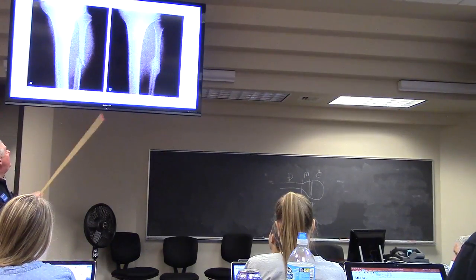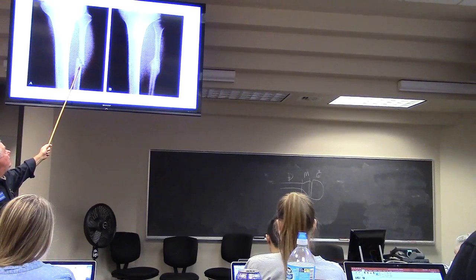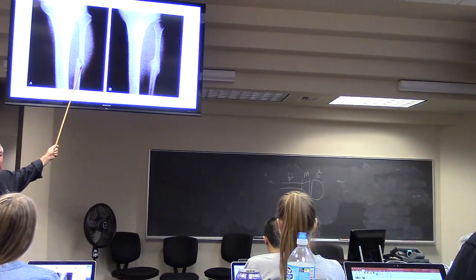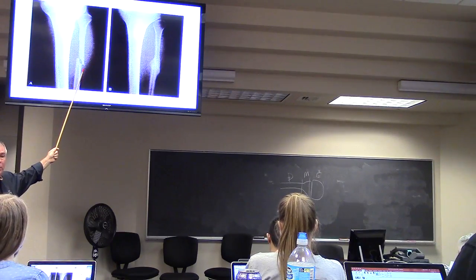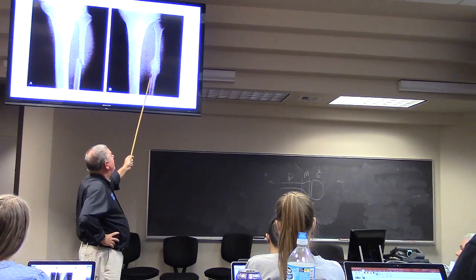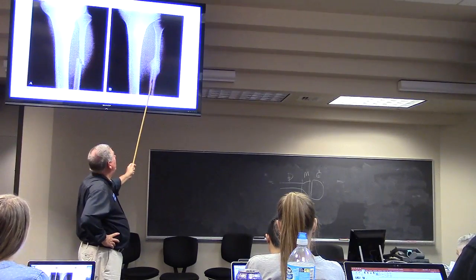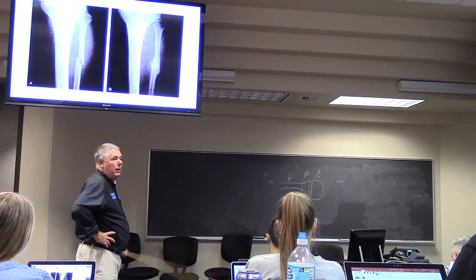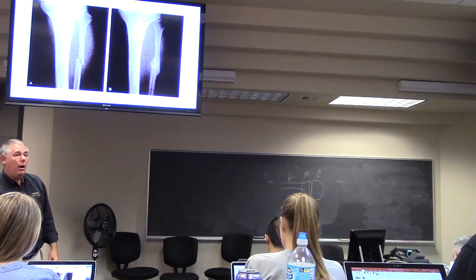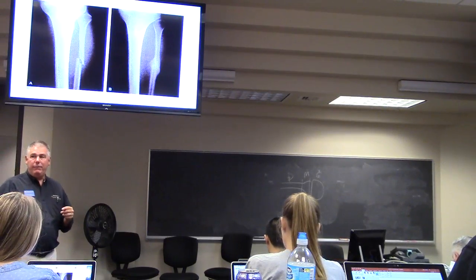This is what you want to see. Here's a fracture through the fibula. That's reduced pretty well right there, but you see it's not perfectly lined up. You wait about 3 weeks or a month, and you're going to see this. You see the callus around it? You see it's still not lined up. And it eventually will be almost perfect, but usually not ever perfect.